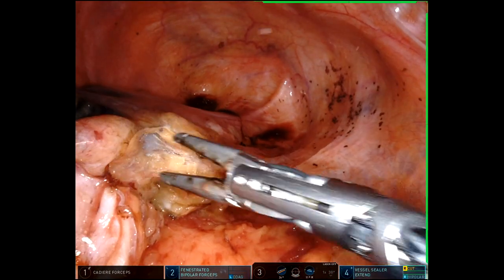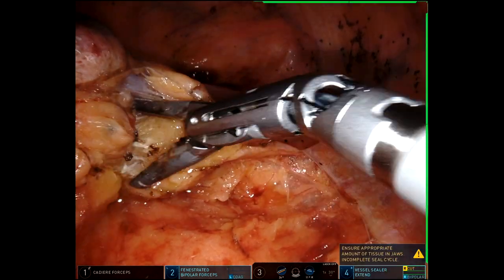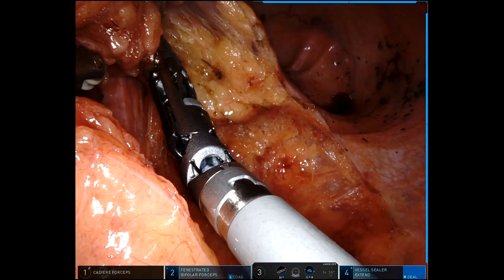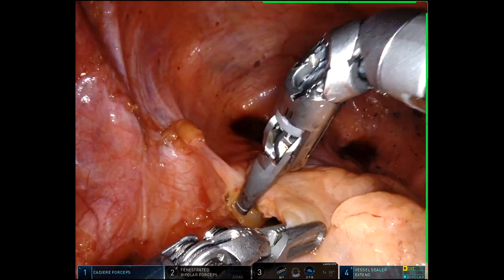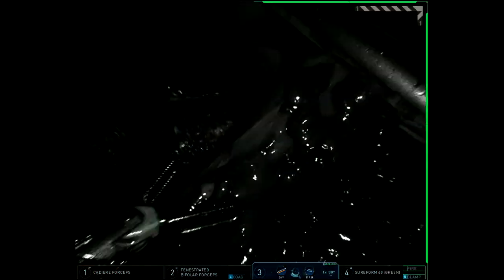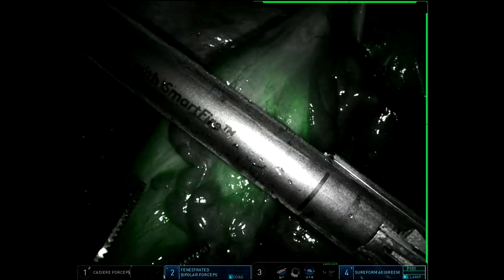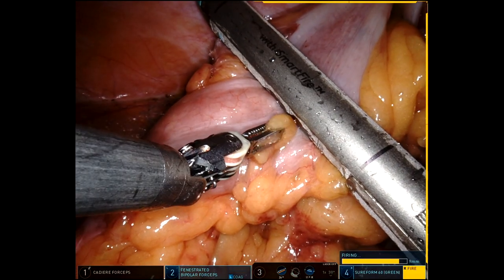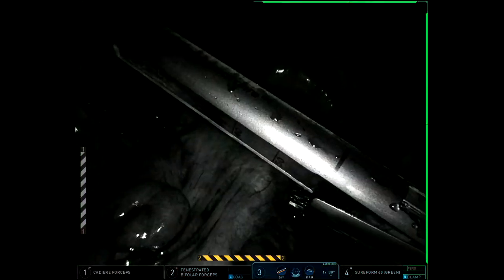I avoid EEA staplers — it's a personal preference — and I do mostly intracorporeal anastomosis, particularly because I'm avoiding the EEA and I like to sew. So my plan for a cancer case is: I don't open the bowel that has the tumor segment, I distally staple, proximally staple, have an isolated segment of colon with cancer in it, and then do my sewn two-layer anastomosis. Had the patient's tumor and mesentery been less bulky, I would have attempted a transrectal extraction of the entire specimen, but I didn't think I could do that without tearing.